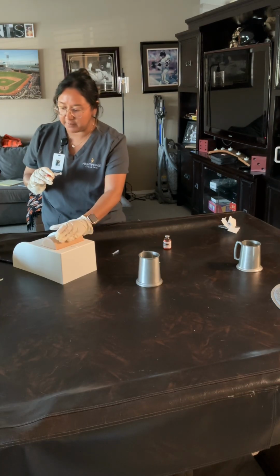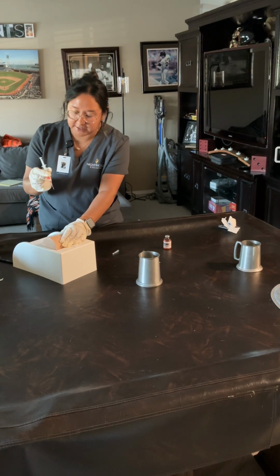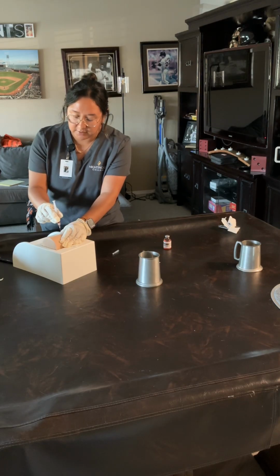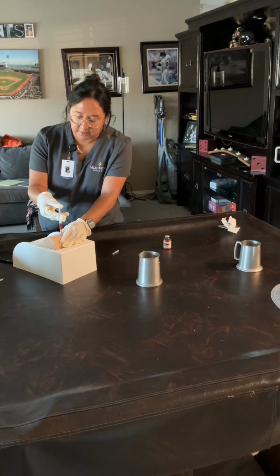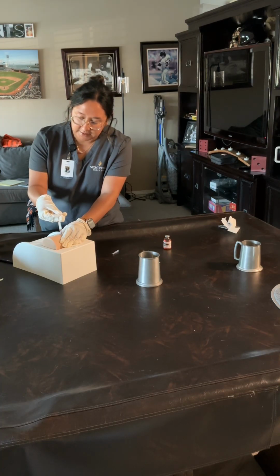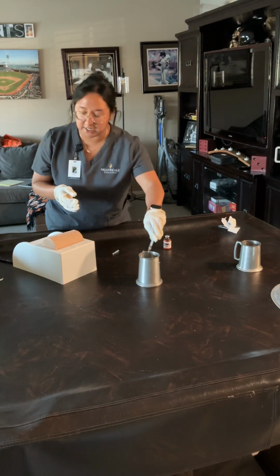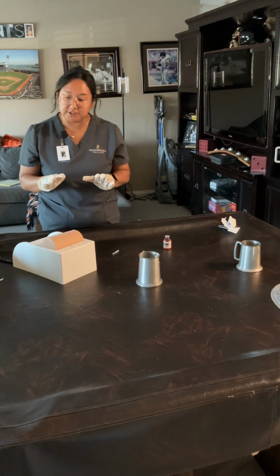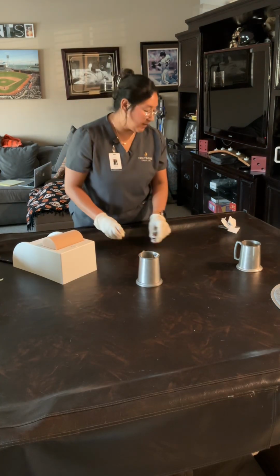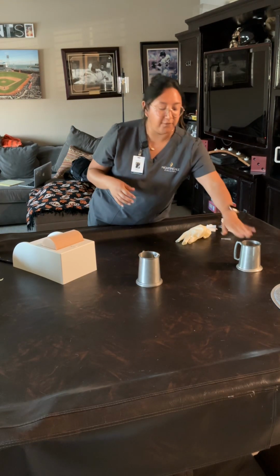I'll go ahead and pull down, and I'll pinch and grab, and I'll place it into a 90 degree angle. And I'll do 10 seconds per milliliter, so it'll be nice and slow. Go ahead and do that. Okay, and I'll hold for 10 seconds. And then I will remove the needle, check for any bleeding, put it in the sharps container here, and make sure my patient's okay. I will go ahead and gather all my supplies, throw everything away, I'll take my gloves off and perform hand hygiene.